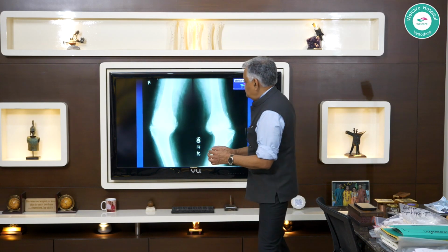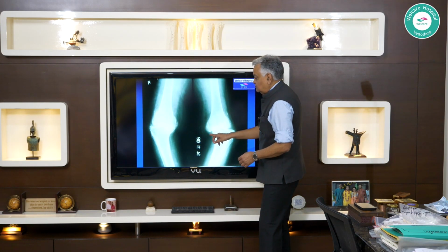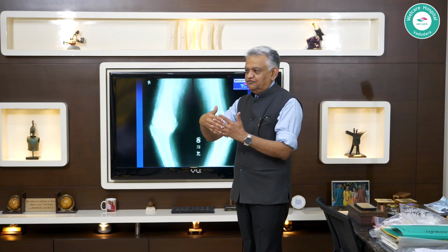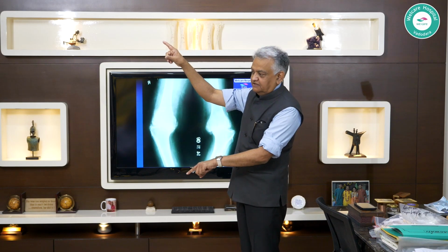The whole purpose is to remove the volumetric dimension of this tiny little body, which is encased within the MCL fibers. So if you just try to take the last bit out in toto, you will be horrified to see maybe 50% of your MCL fibers separate. One part here, one part there.